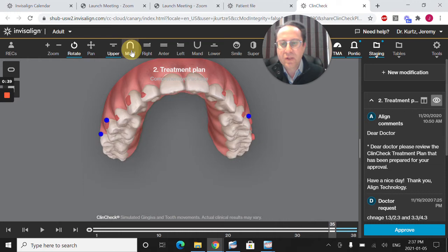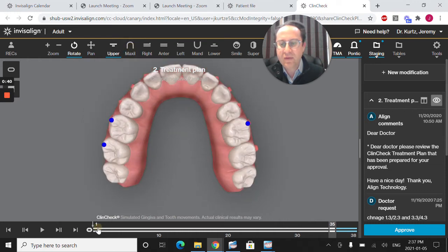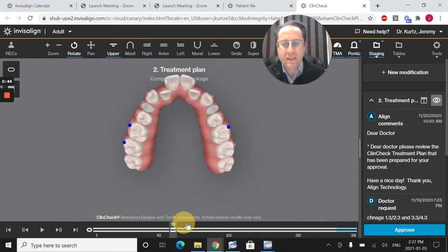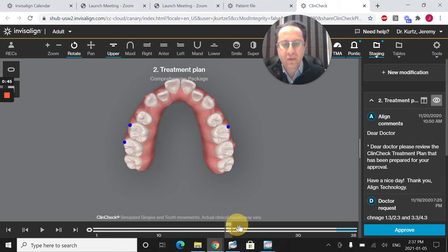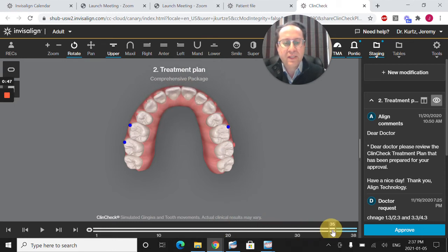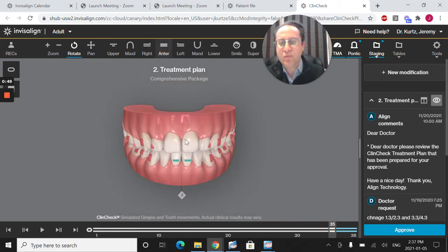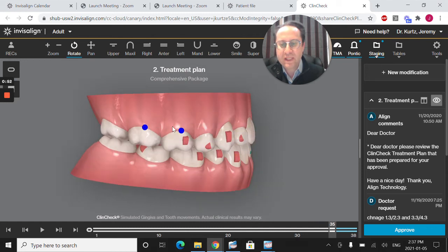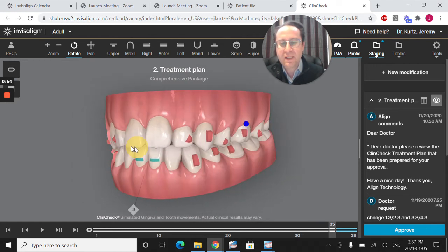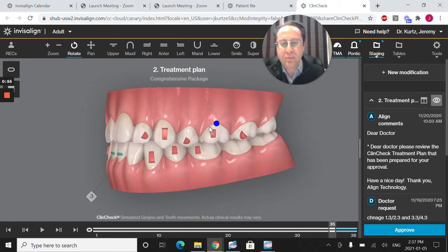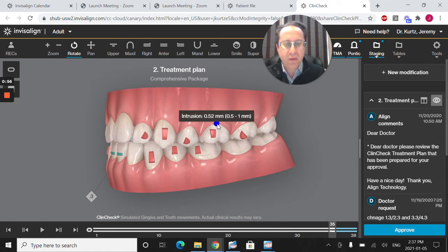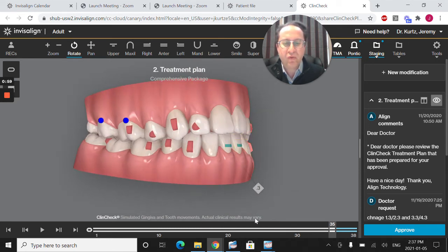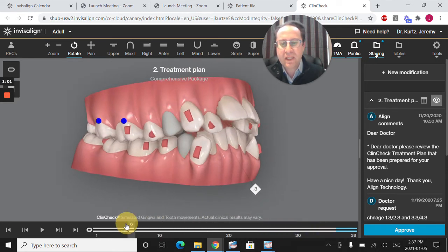So all of a sudden, from something which looks really difficult, overall it's not that difficult of a case. You can see we rate the types of movements with the tooth movement assessment tool, and there's only blue areas in the back with minimal intrusion. So really, none of the movement is even considered to be difficult.